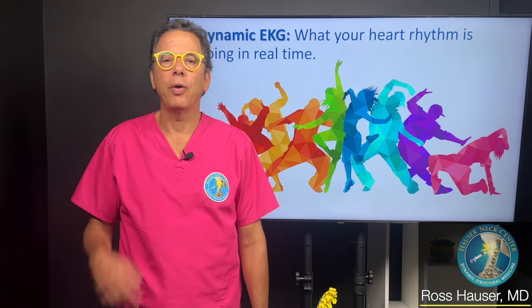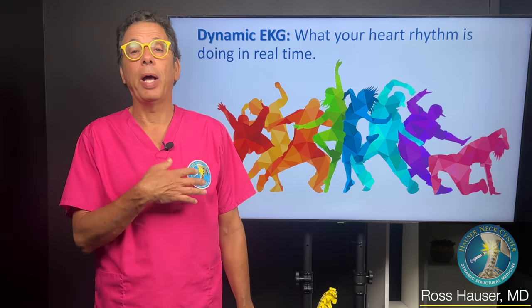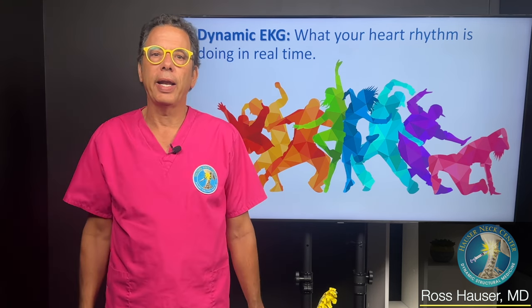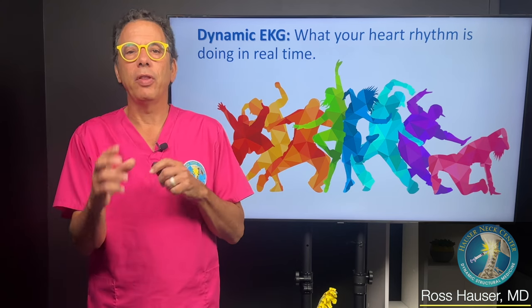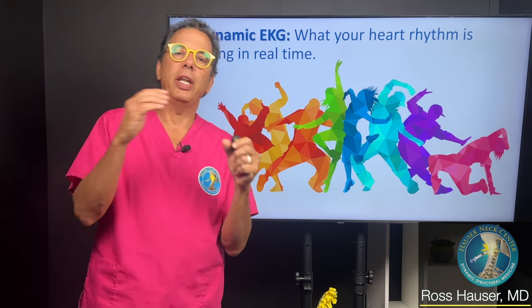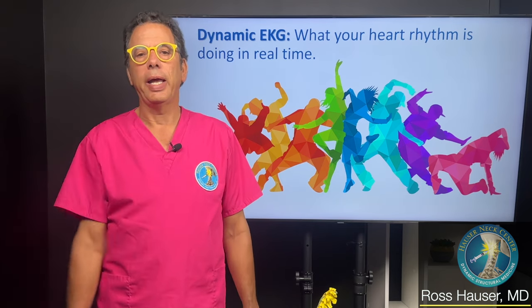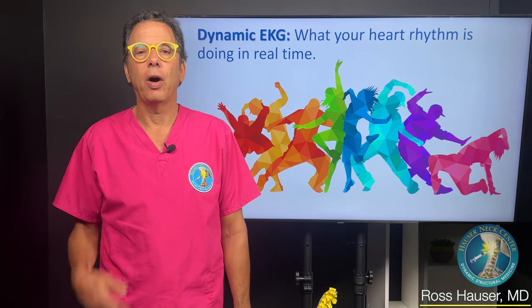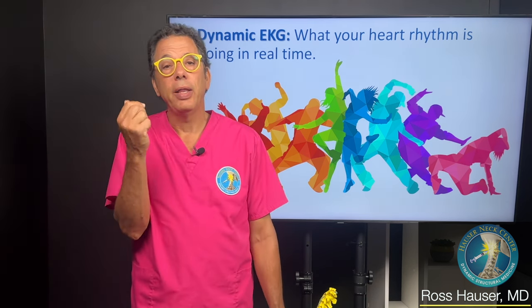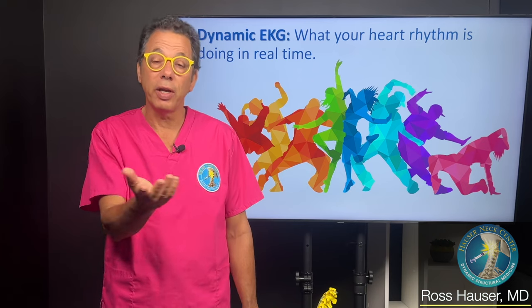Today I'm going to talk about how you at home can monitor your EKG and try to figure out, are your palpitations, your dizziness, and other symptoms from your neck? Because a lot of times when people have symptoms suggestive of a heart arrhythmia, or they have dizziness with standing that they don't have with sitting down or laying down, which is called orthostatic hypotension, they often are referred to a cardiologist. And the cardiologist will look at the EKG. They might even have the person monitor themselves at home, so they have different chips and different things.